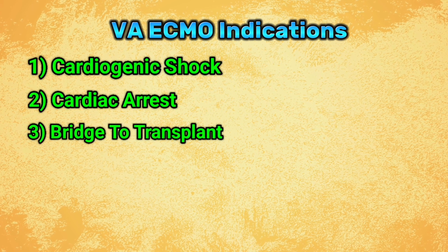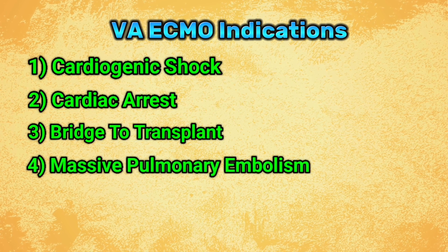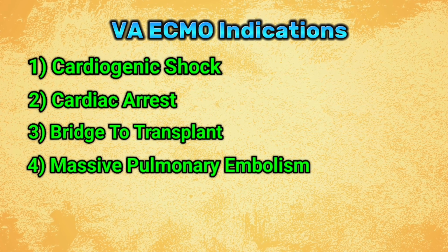Third indication is bridge to transplant. The patient can be put on ECMO until he or she gets a heart from a donor. Fourth is massive pulmonary embolism with right heart failure and with hemodynamic instability.